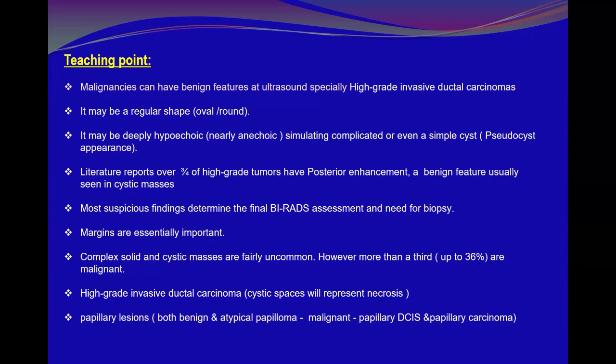Margins are essentially important. As we mentioned, and we are always mentioning, margins are the key, margins are the key, margins are the key. Complex solid and cystic masses are fairly uncommon. However, more than a third are malignant. High-grade invasive ductal carcinoma might be associated with cystic spaces, giving the appearance of complex solid cystic masses. It is a solid with a cystic component.